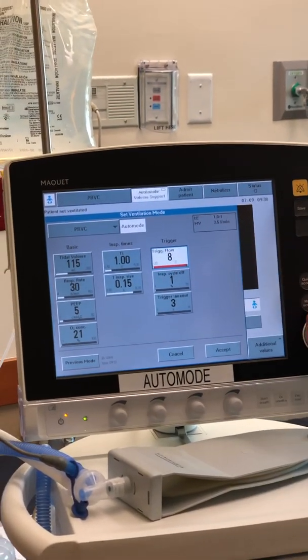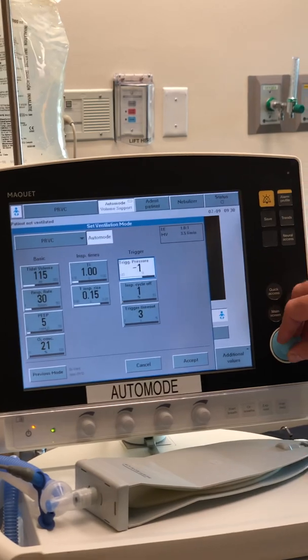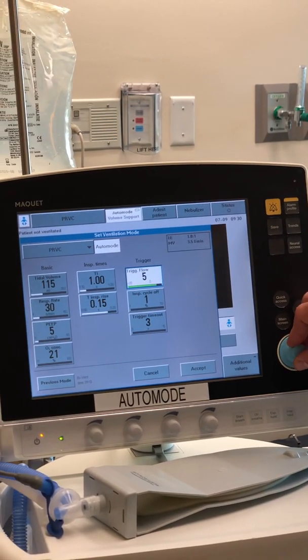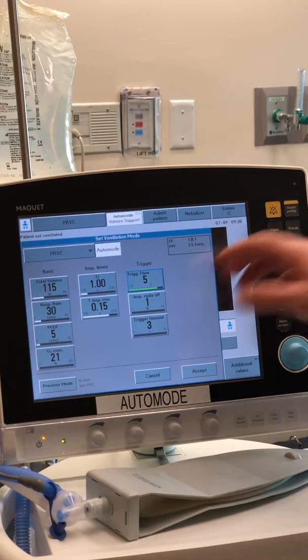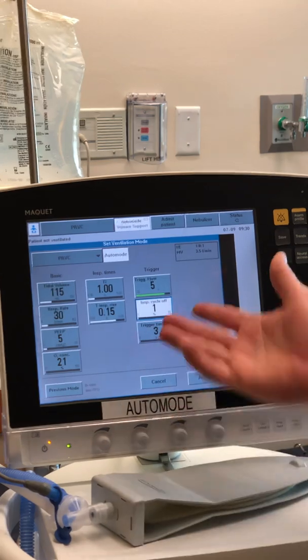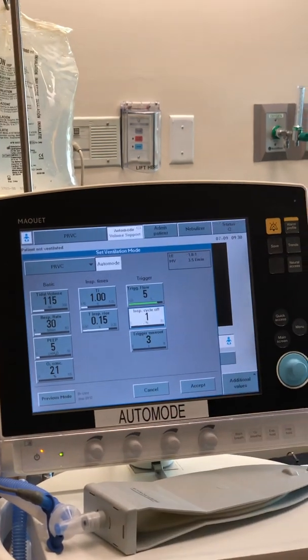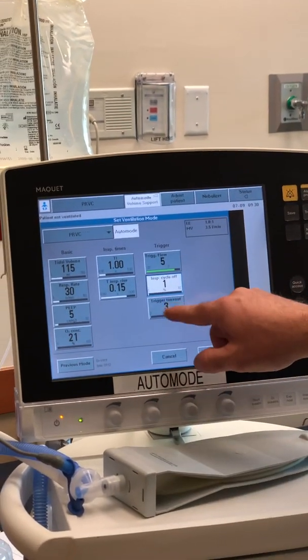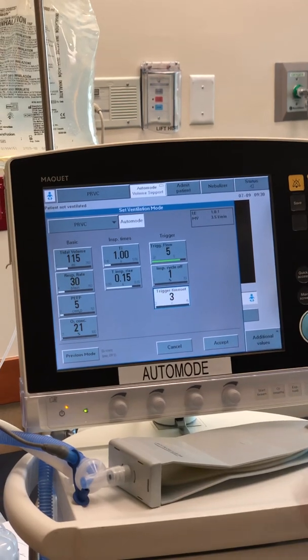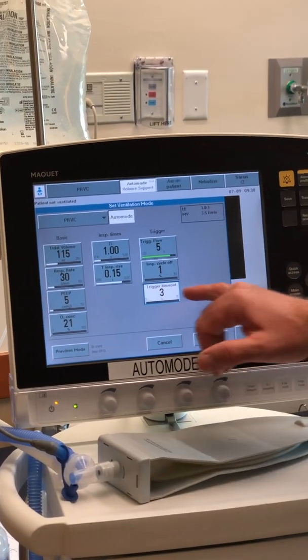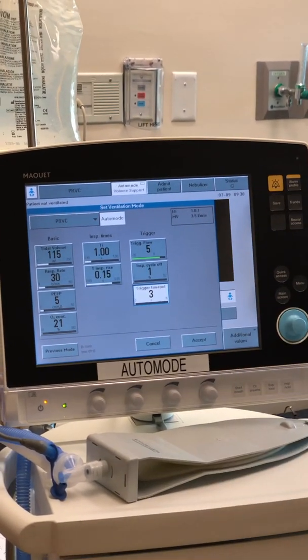Your inspiratory rise is set the same way. The trigger should be as sensitive as possible without auto-cycling — setting it at 10 will cause auto-cycling, so if putting this on a patient, start at your normal trigger setting. Inspiratory cycle is one percent always, unless you see a waveform issue or there's a big leak and you have to change it.